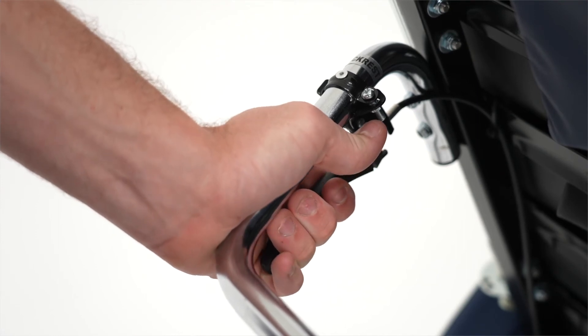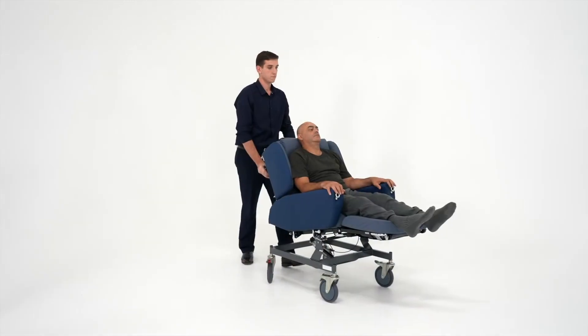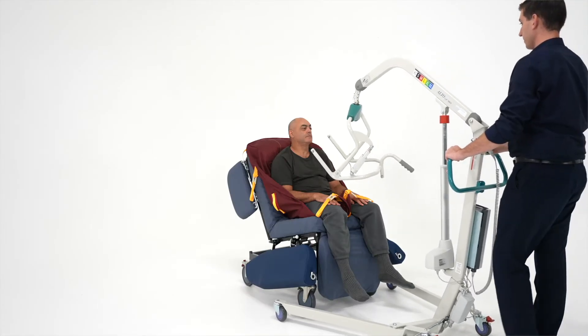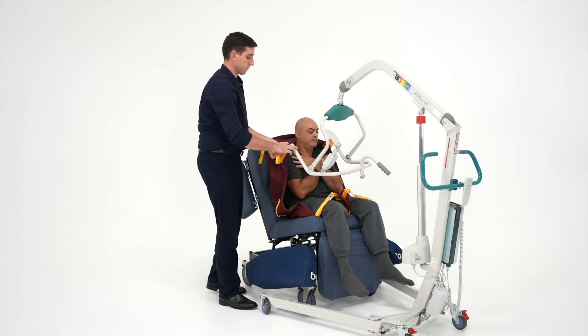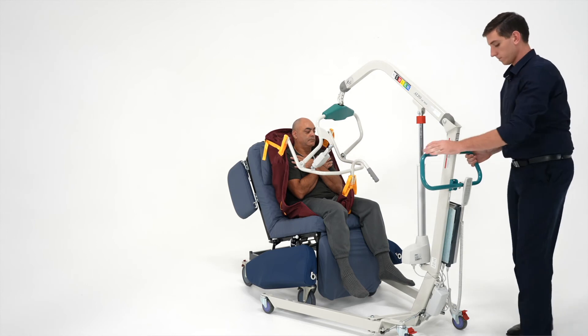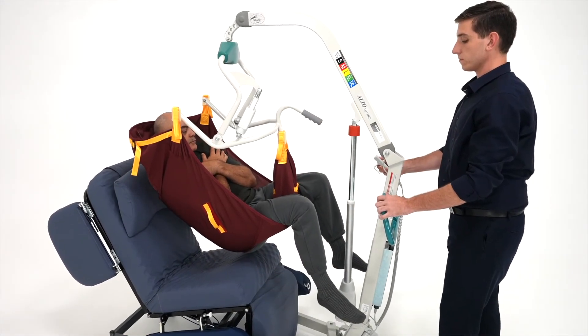Located at the side of the push handles, you'll see the adjustment levers. This allows full control over the chair while repositioning the user. Another advantage of the Regency is that it is compatible with all of our hoists. As you can see here, the Alto Mark II can be pushed in and out allowing for quicker, safer and more compact transfers.